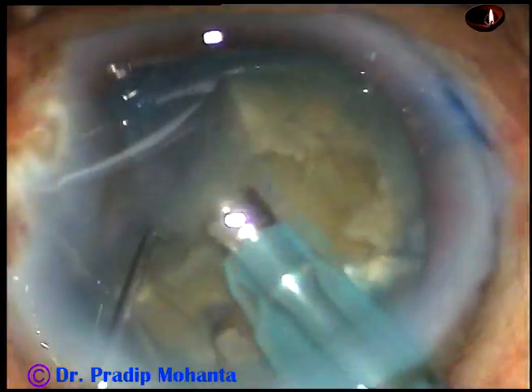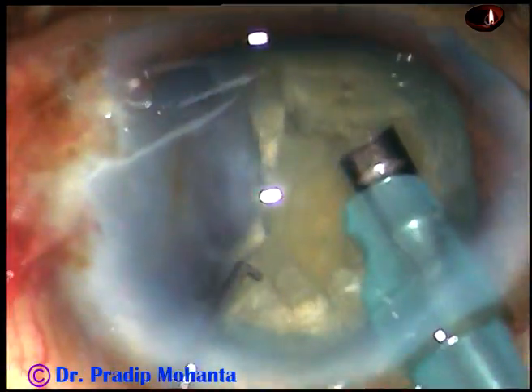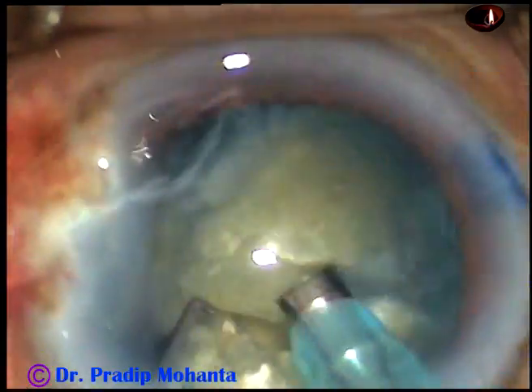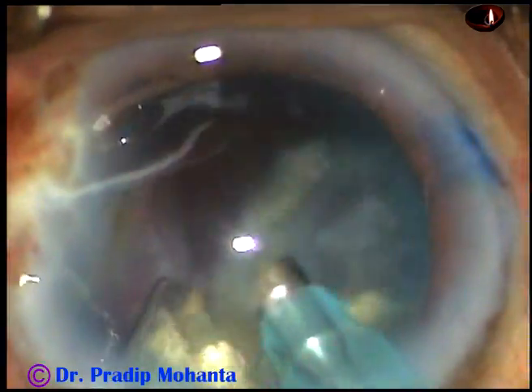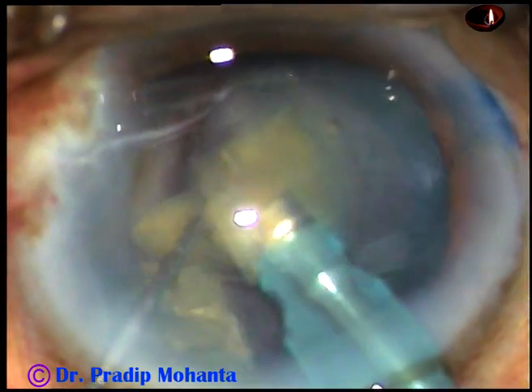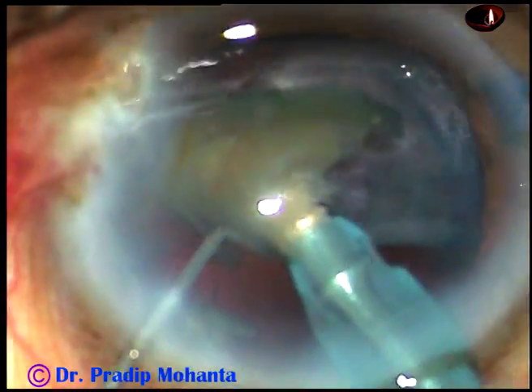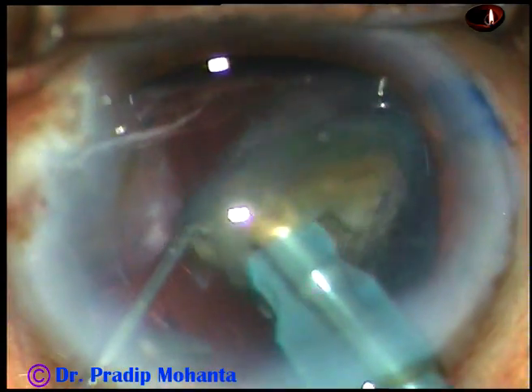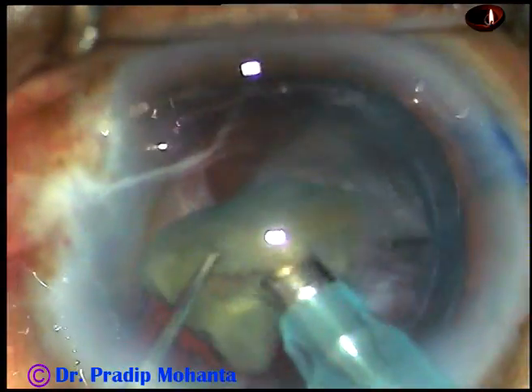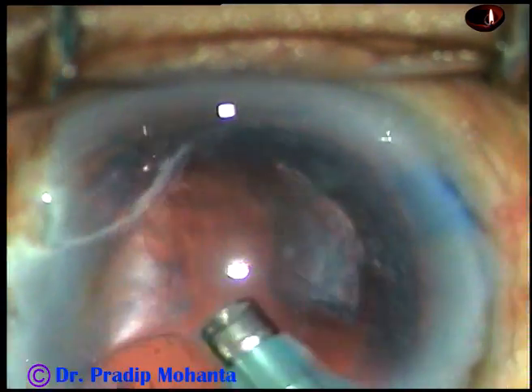And now, after dividing the nucleus into several pieces, each nuclear fragment is emulsified and removed. This is the last fragment, and this is the last nuclear piece. So the nucleus has been managed.